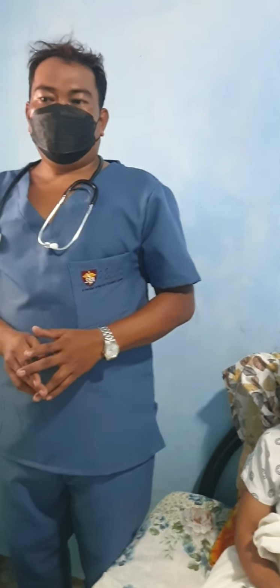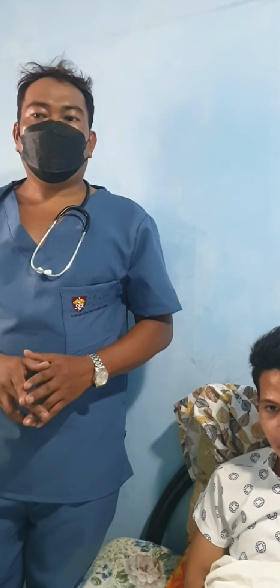This procedure can be anxiety provoking and uncomfortable for many patients. Providing a means for the patient to communicate discomfort and a desire to pause during the procedure helps alleviate anxiety. Place a towel on the patient's chest and provide facial tissues and an emesis basin.